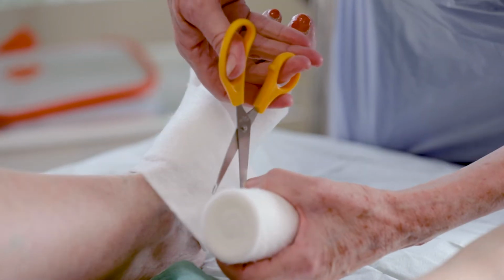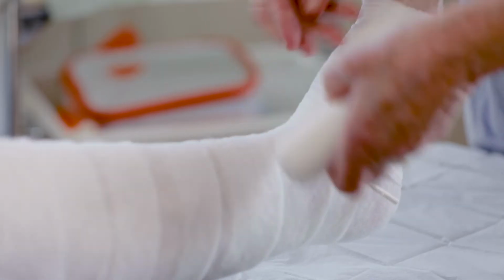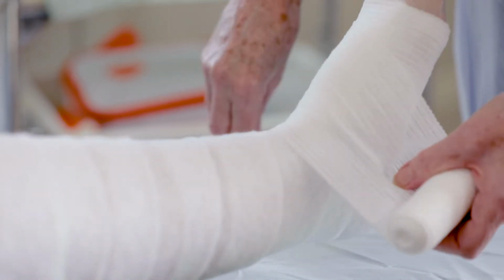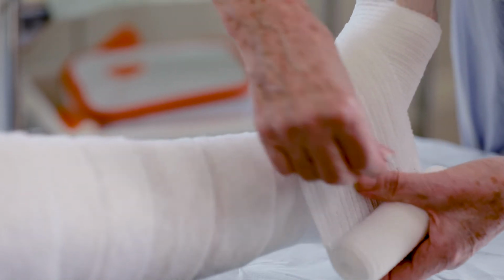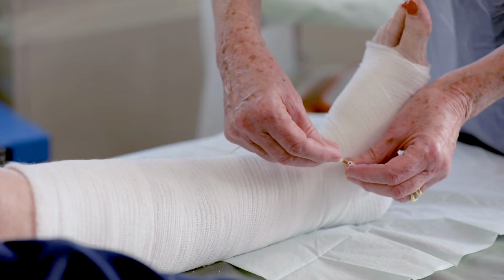Ensure that the electrode wires are fed through the bandage using wadding and a securing bandage to absorb exudate and avoid any pressure injuries from the wires. Once you have completed the dressing, you are ready to connect the Accel-Heal Solo device to the electrode pads.